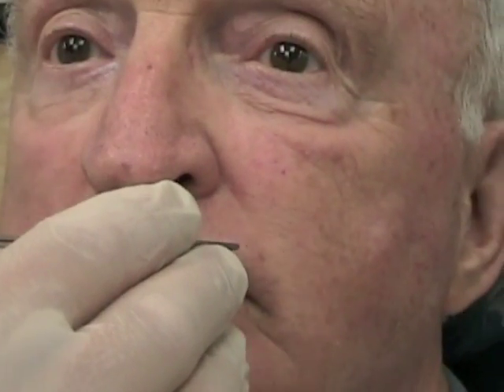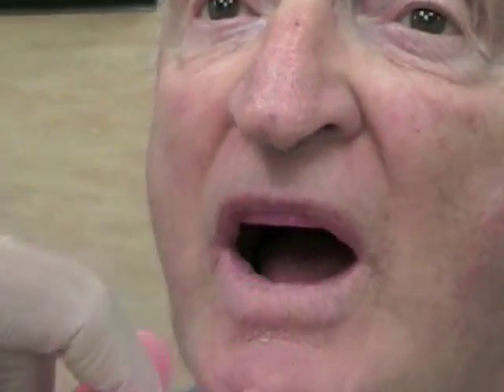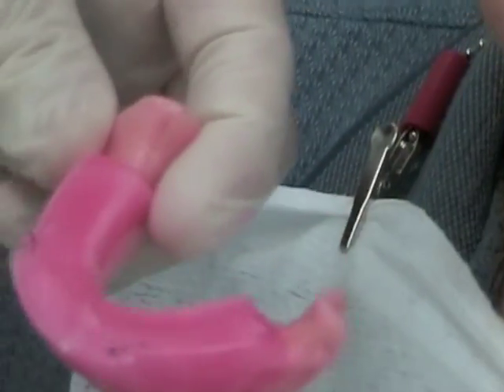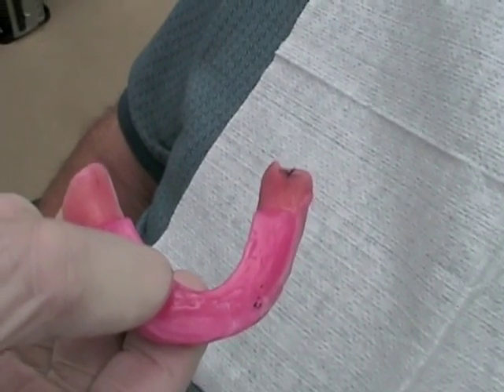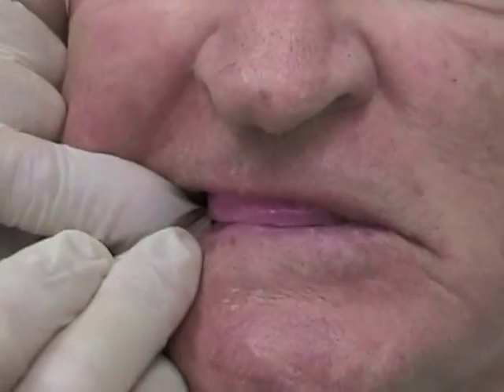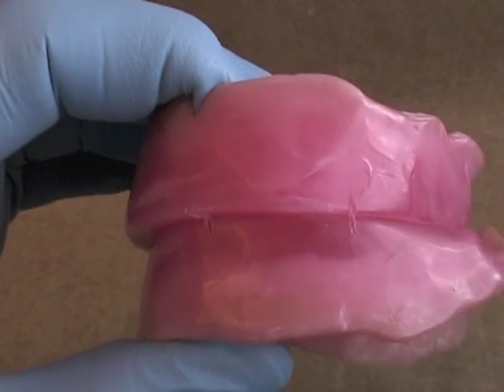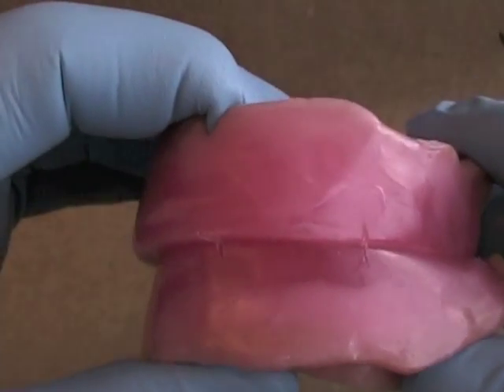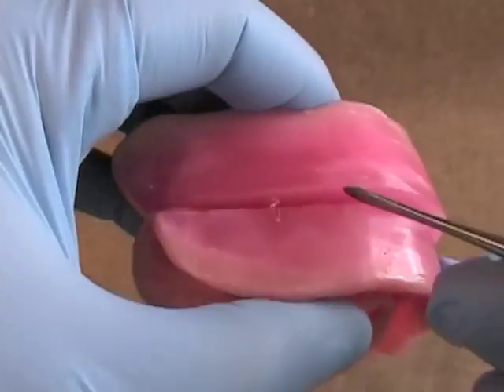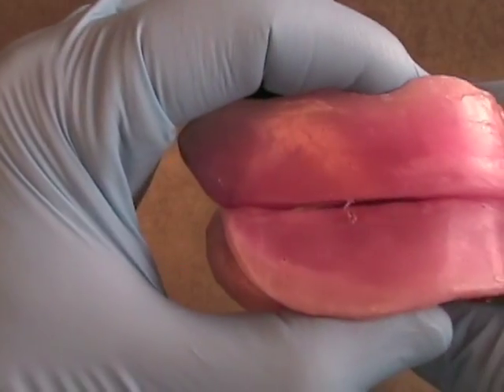Check the proper relationship of your rims and the absence of interferences between the record bases using articulating paper. Have the patient tap together, then remove the rims and record bases from the mouth and check that the record bases aren't hitting at the back — a heavy contact will leave a clear mark at the end of the base. Another technique is to place three widely separated marks between the maxillary and mandibular rims. When you remove the rims from the patient's mouth and align those three marks, there is only one position where all three line up. Watch for interferences where the record bases are actually hitting the rim and preventing the rims from touching together — that's extremely critical. Also watch for a maxillary rim that's been extended too far back, as this will cause interference when the patient protrudes.